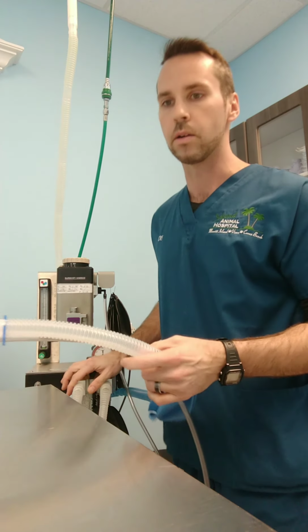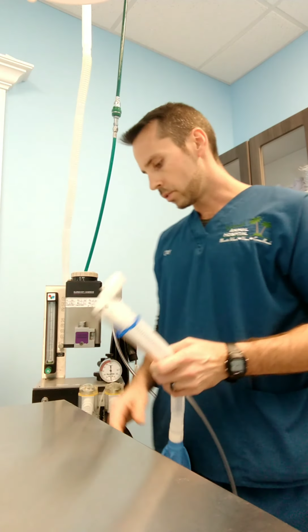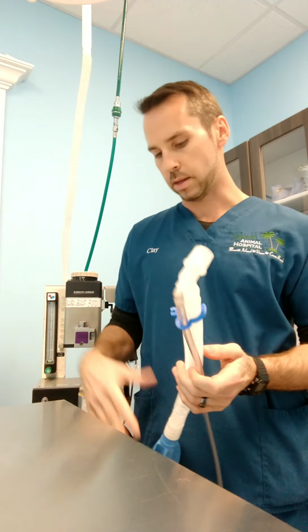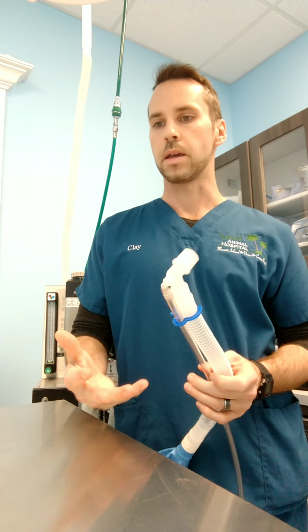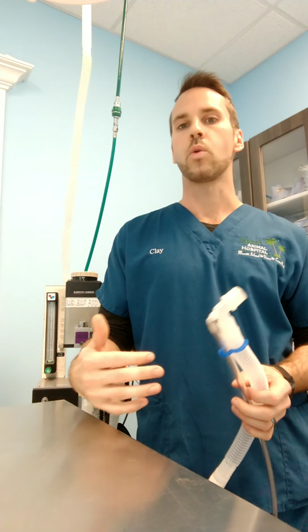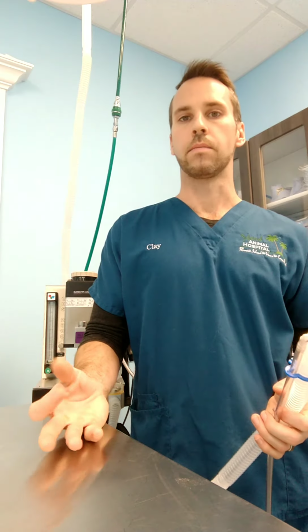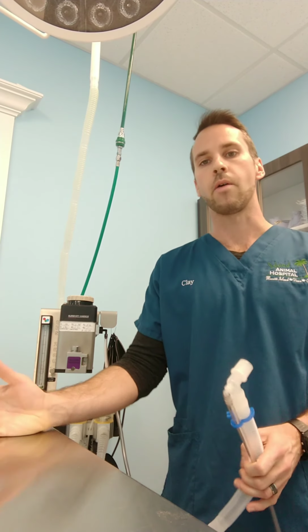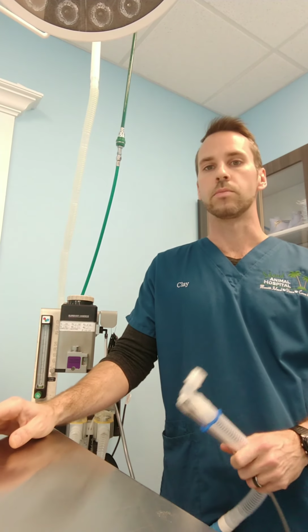There's no inhale or exhale valve. So the non-rebreathing systems are mainly used for patients who are under 15 pounds because it gives shorter dead space and it's easier for them to breathe. It does require a higher oxygen flow rate, so the only drawback being that it can be a little bit more expensive than a rebreathing system. And that is how our non-rebreathing anesthesia machine works.